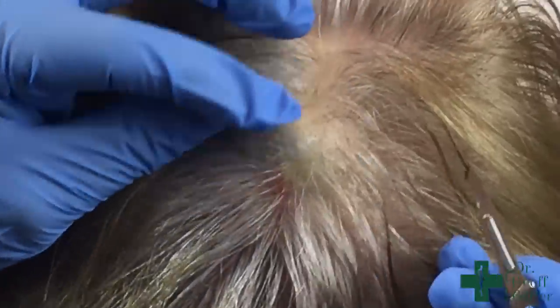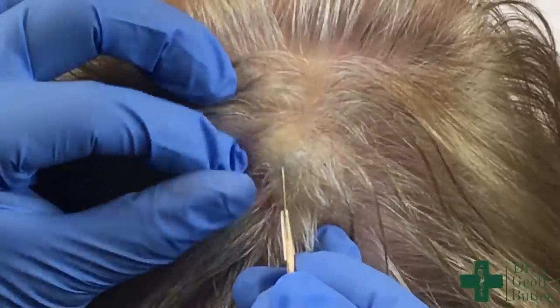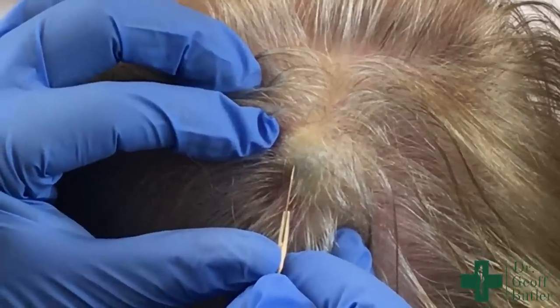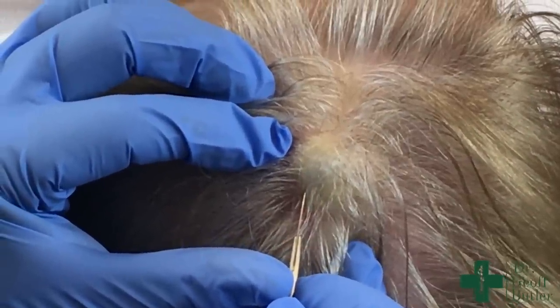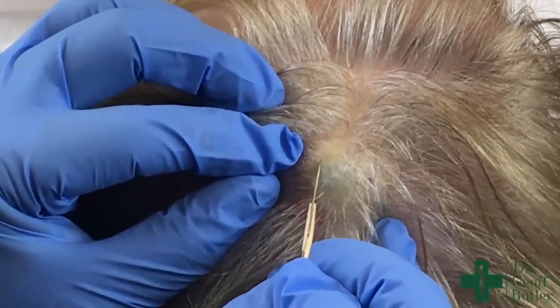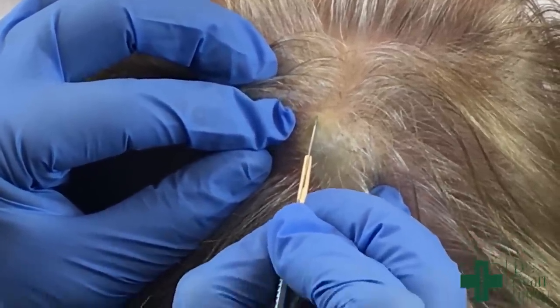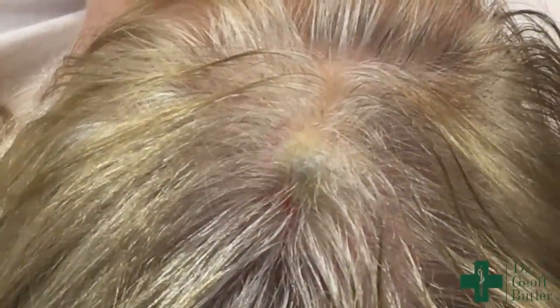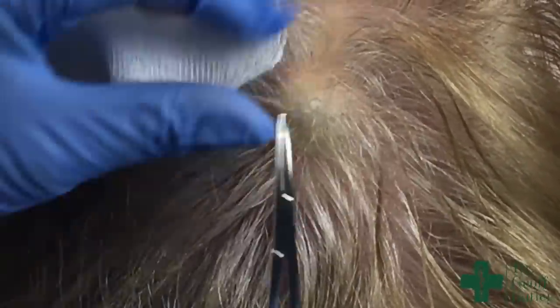From the choice of a blade, this is a number 15 blade, which I'll use. As long as you go slowly, that's the biggest issue. Catherine, you'll feel some pressure but you shouldn't feel any real pain. If you feel anything, let me know. The key with this one, because it's laying right at the surface, is just to take your time and then it'll open up.